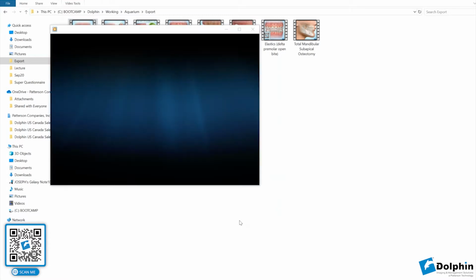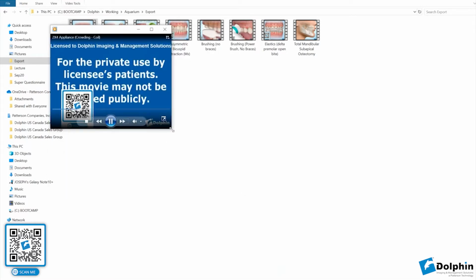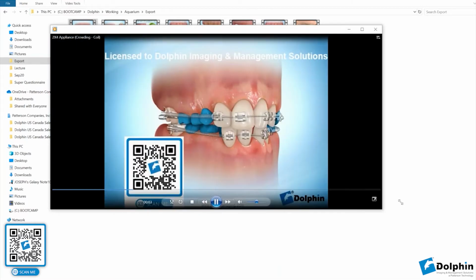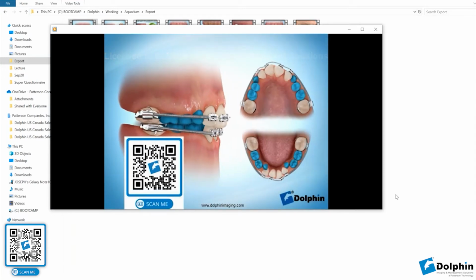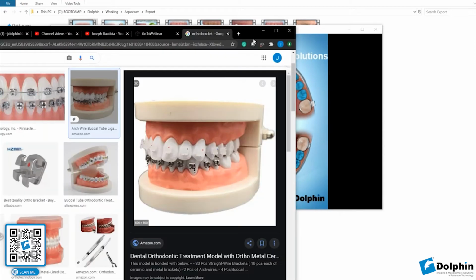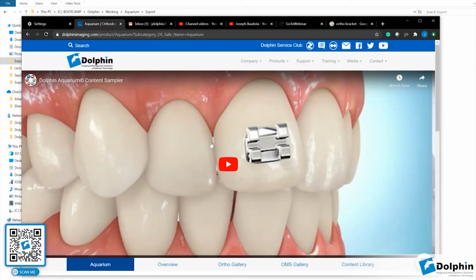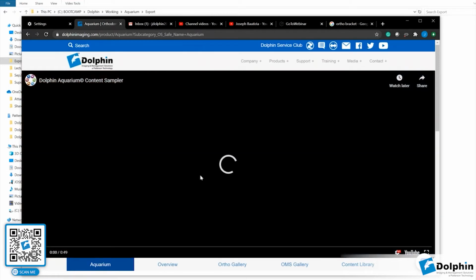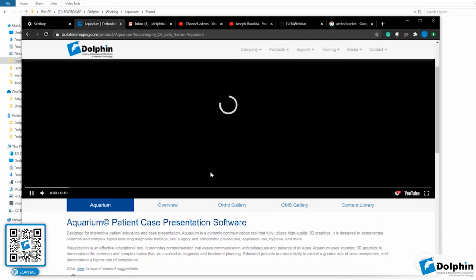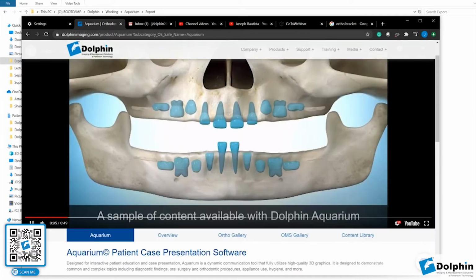And since it's a regular Windows media file, it's only limited by your imagination on what you can do with these videos. You can implement them on a PowerPoint presentation. You can even implement them on your office website. So as an example, if you want to view what it might look like on your office website, take a look at dolphinimaging.com, and you can see we've implemented several videos on our website, kind of like samples, so you can see how it works.